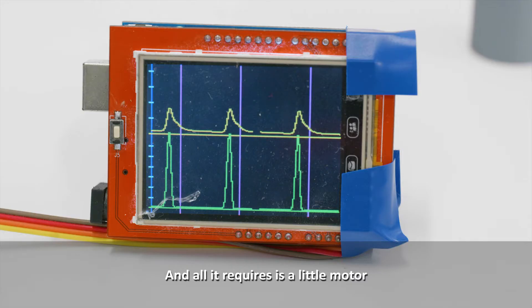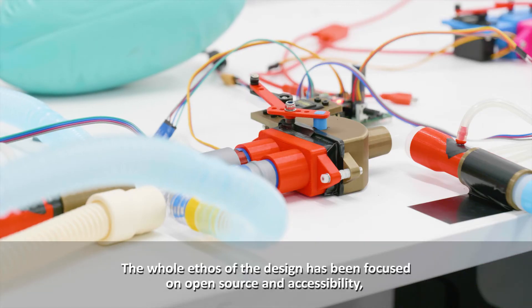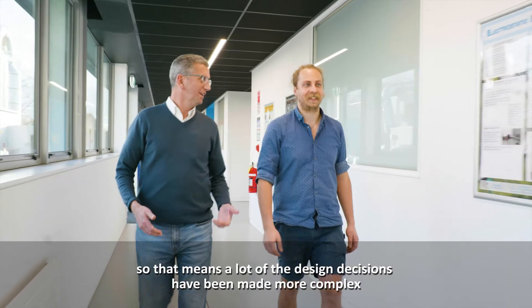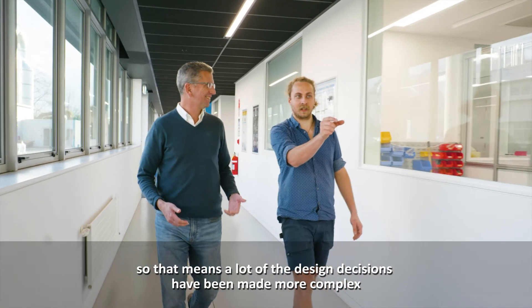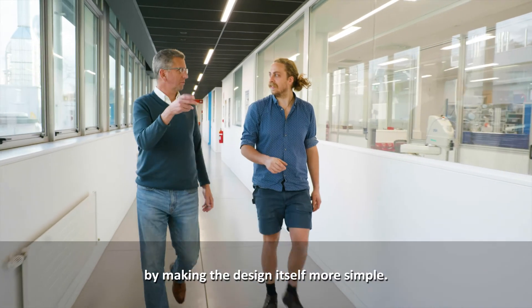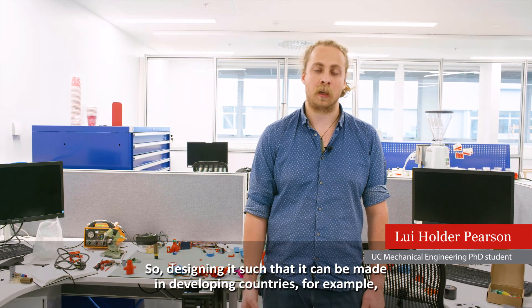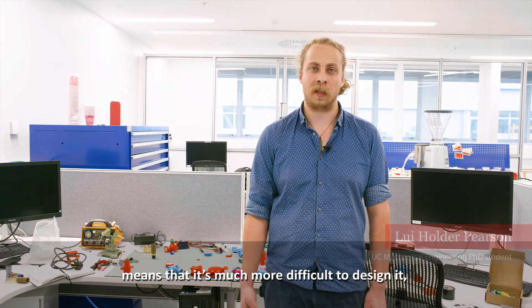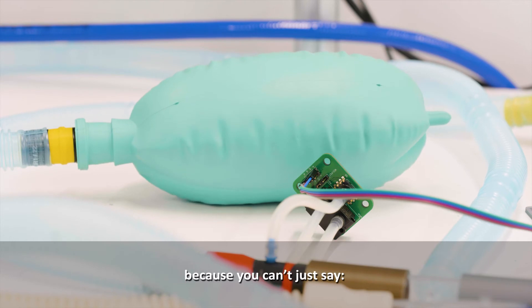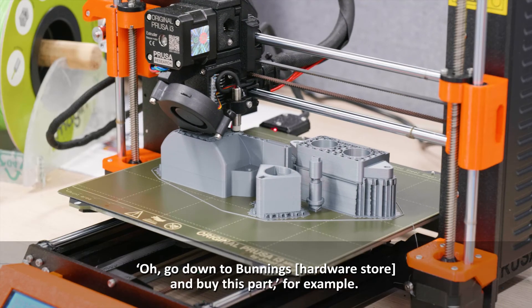All it requires is a little motor and a little sensor. The whole ethos of the design has been focused on open source and accessibility, which means a lot of the design decisions have been made more complex by making the design itself more simple. Designing it so it can be made in developing countries means you can't just say 'go to Bunnings and buy this part.'